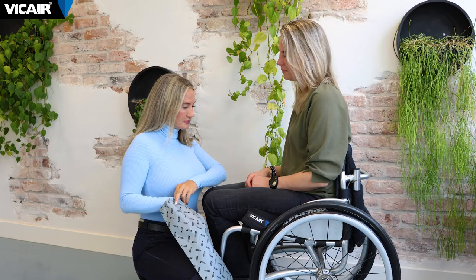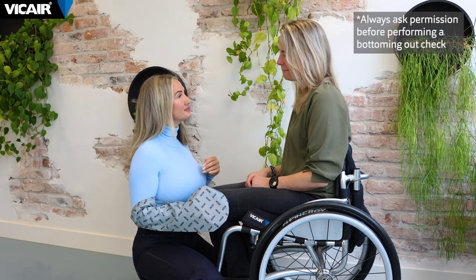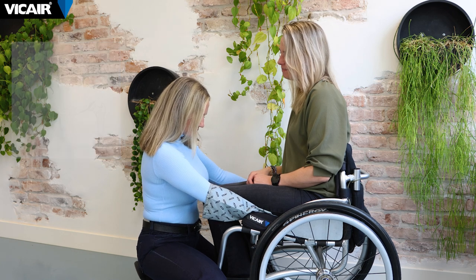Put on a slide glove and slide it over your hand and arm. Slide your hand with the palm facing down under the buttocks until you reach the ITs. Apply light pressure downward with your fingers to measure the space between the bony prominences and the bottom of the cushion.